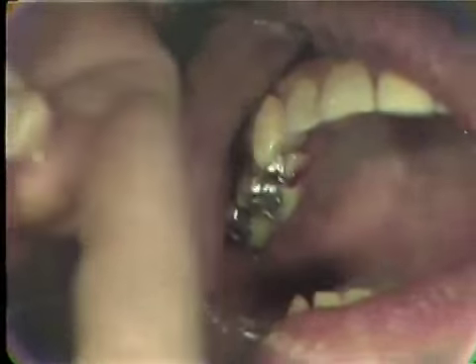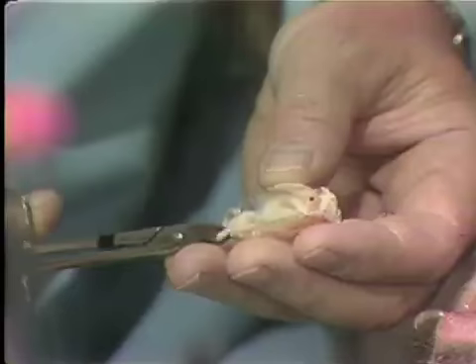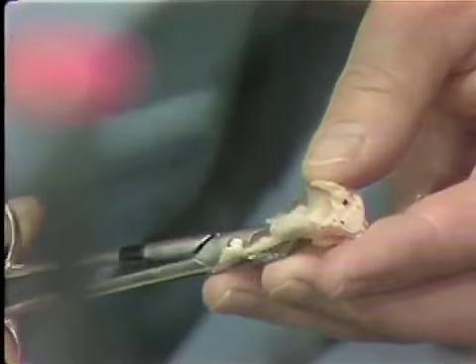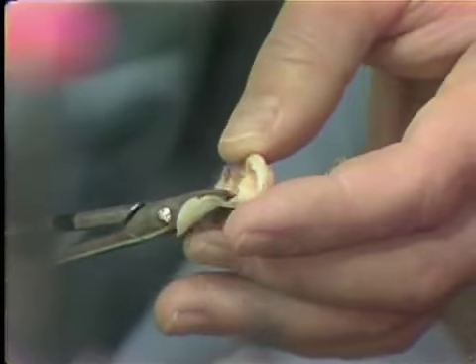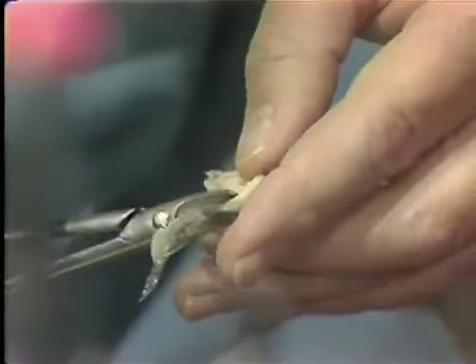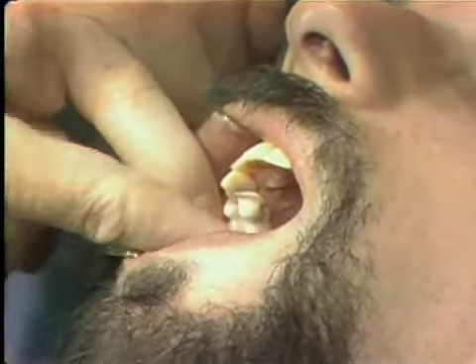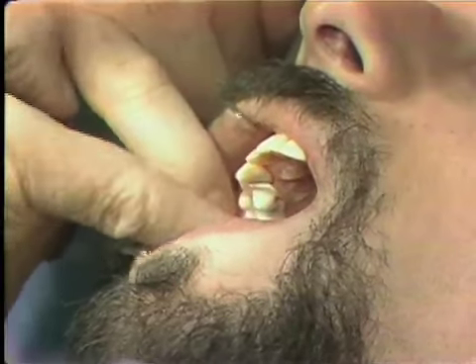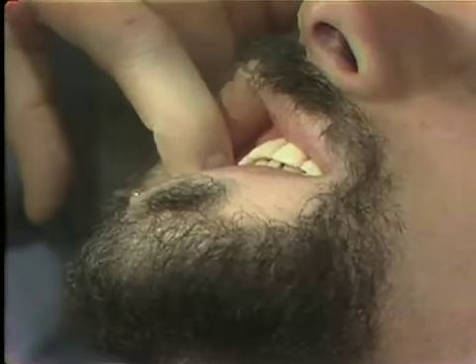If you have sufficient time for the set of the acrylic material, you can take a pair of scissors and start trimming away the excess material. Now, this thin shell material will not adhere or stick to the acrylic, so that the shell will come off when the temporary is finished. Close, please. Open.